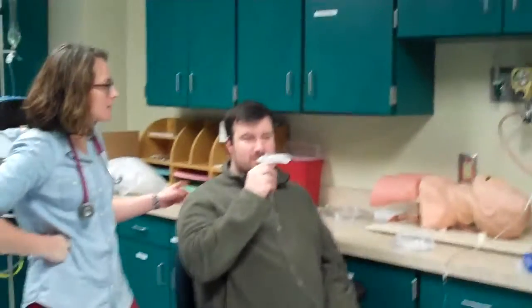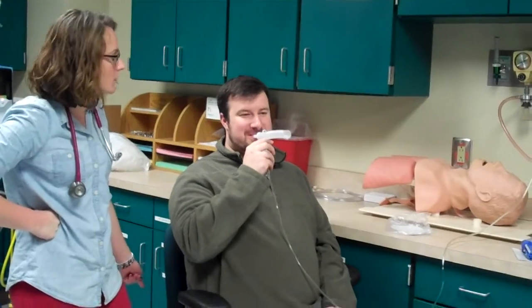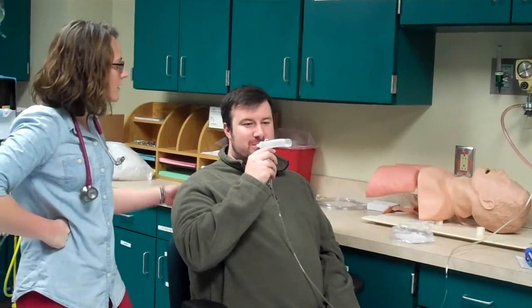Why is he holding it, Victoria? Why is he holding a deep breath in? What's he trying to do? Oh, you're trying to make sure all of the medicine gets down in your lungs, and you hold it there and pop some alveoli open and hope that it gets way down in there. Oh, I remember seeing something about that. So deposition and sedimentation, where the medication rains out because there's no flow. I want to make sure it gets down in there. Man, you did that good, son. You still feeling alright? Not lightheaded or anything? Good. Alright. Breathe normal. Now let's try that one more time.